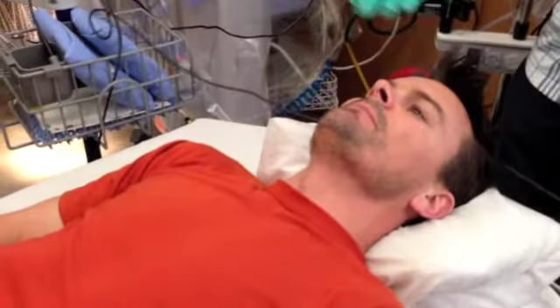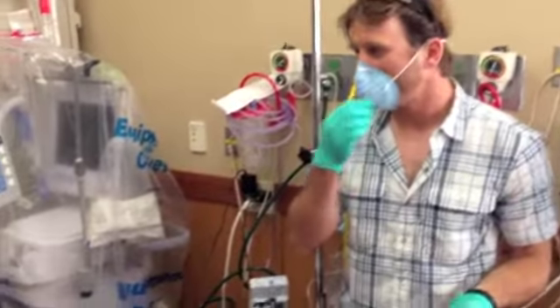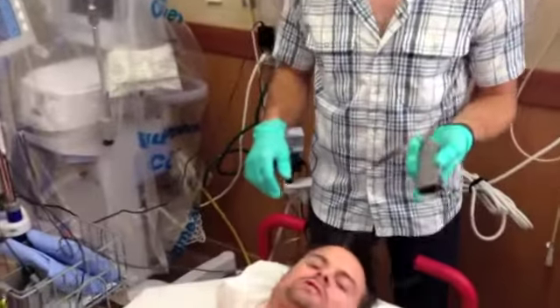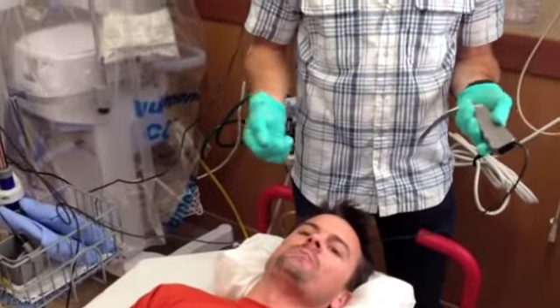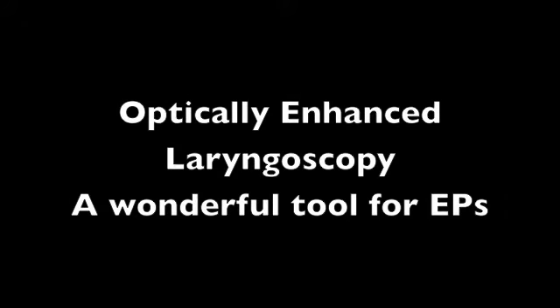Certainly if he were a little more relaxed. Even a grade 2 view is enough to pass a bougie if that's all you got. And then once you get a bougie in there, you can push your paralytic confidently.